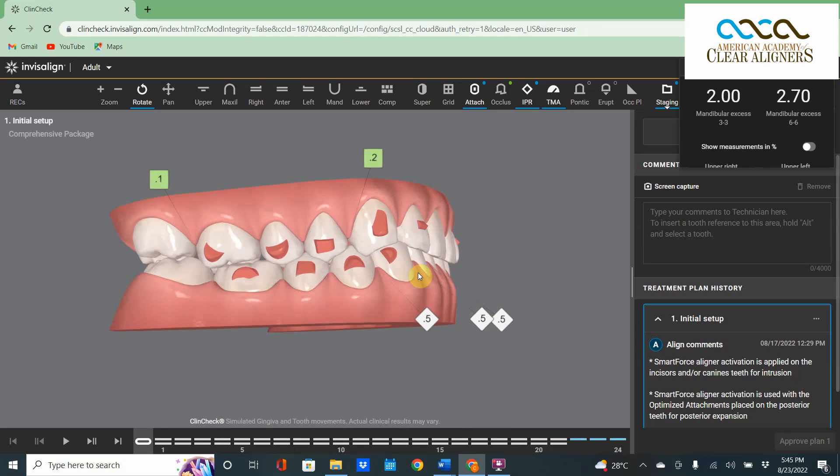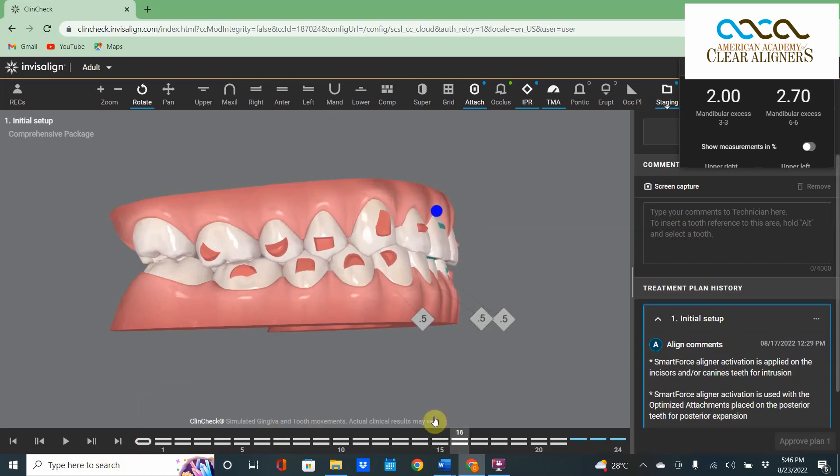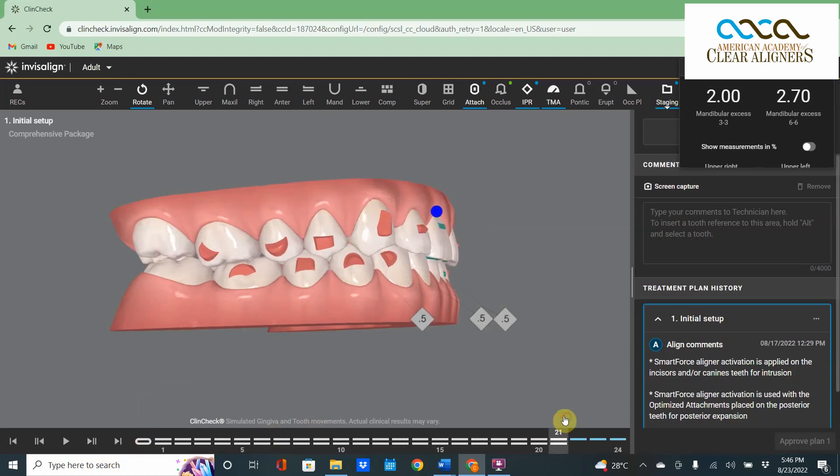This condyle is trapped posterior superior. As soon as you move these anterior teeth out of the way, as soon as you procline those anterior teeth, that lower jaw is going to come spinning forward.